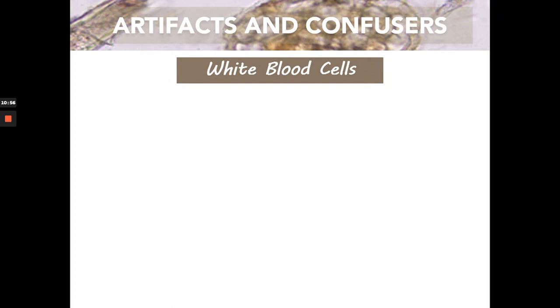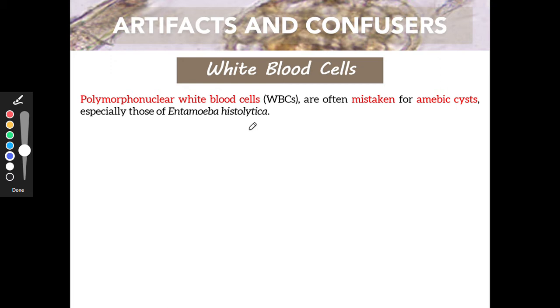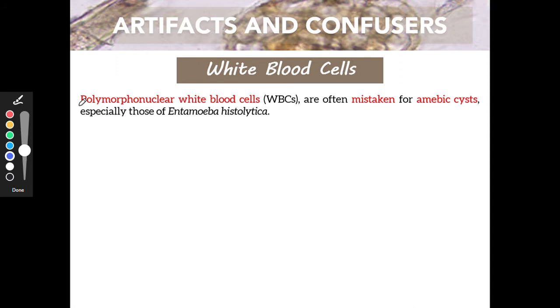Now we go to the different artifacts we can see in samples. Most focus on stool samples, with the later part covering blood sample artifacts. For stool samples, we start first with your WBCs — your white blood cells — also known as polymorphonuclear white blood cells, abbreviated as PMNs.